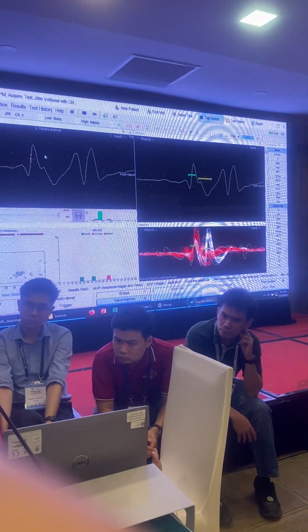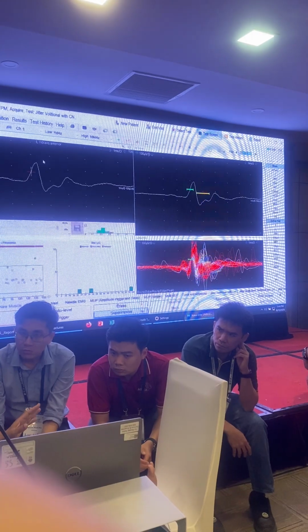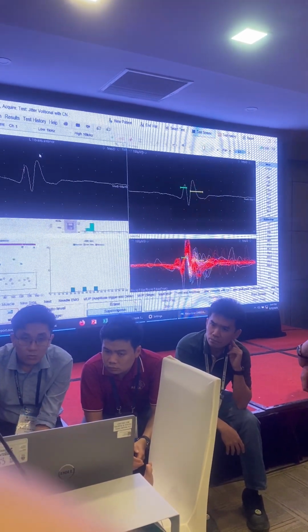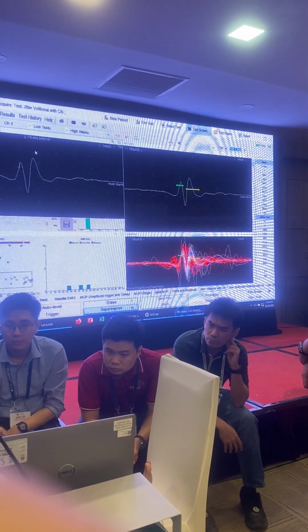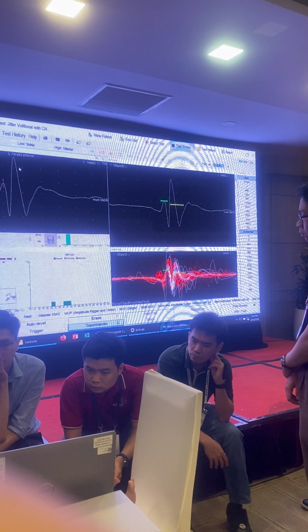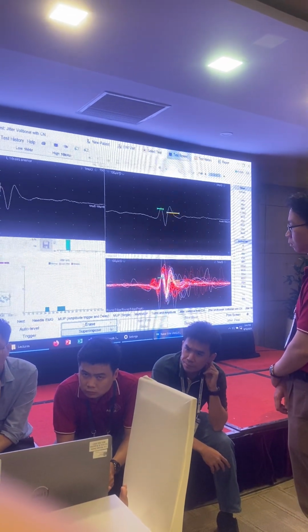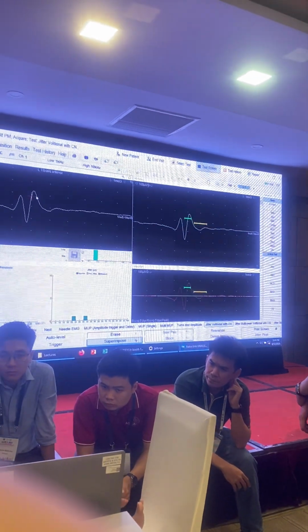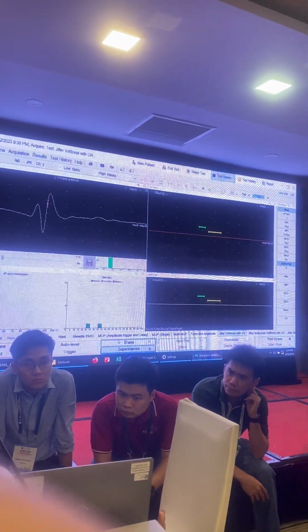I just don't go like, if you try to do like this, give me more force, now you get nothing. So that's a good position.